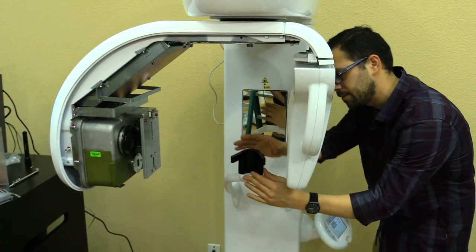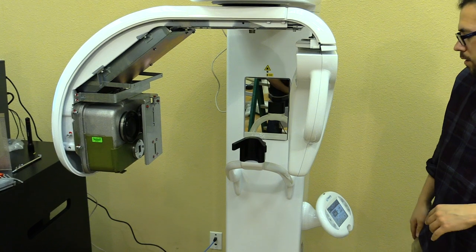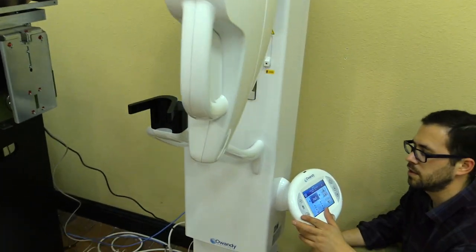It's important that the phantom tool goes all the way down and touches the bottom of the chin rest positioning. Next, we'll walk over to the control panel and get back into the system configuration menu.